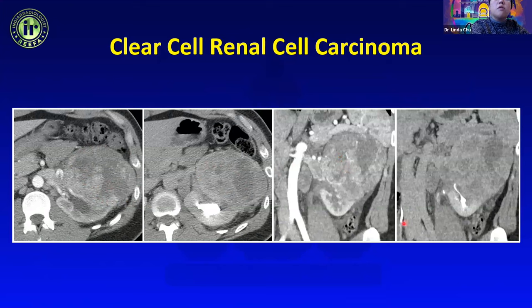A look-alike for solid renal neoplasms is oncocytoma. The classic feature is a central stellate non-enhancing scar. When you have something like this you can be fairly confident it's an oncocytoma, but realistically it can be difficult to differentiate from renal cell carcinoma on both imaging and biopsy.